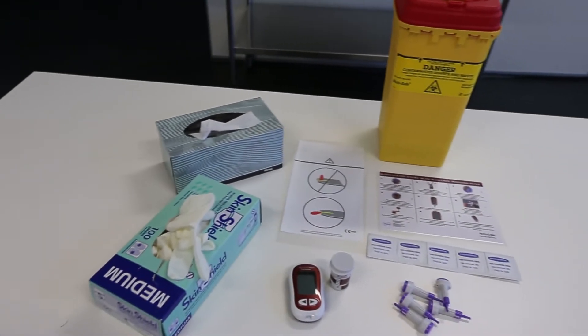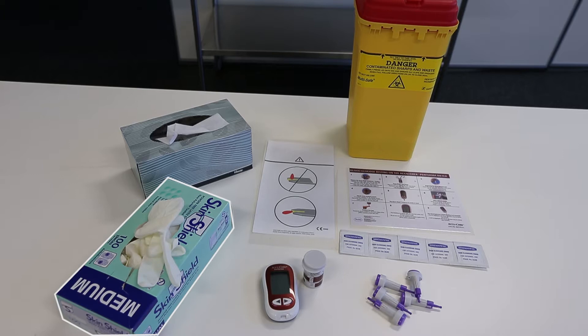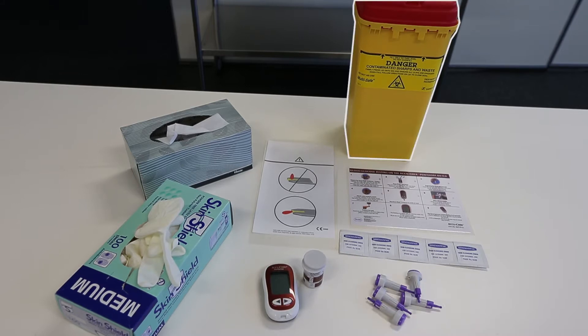The equipment you will find at the station for taking blood glucose are gloves, tissues, a set of instructions, some alcohol swabs, the blood glucose meters, lancets, and the sharps bin.